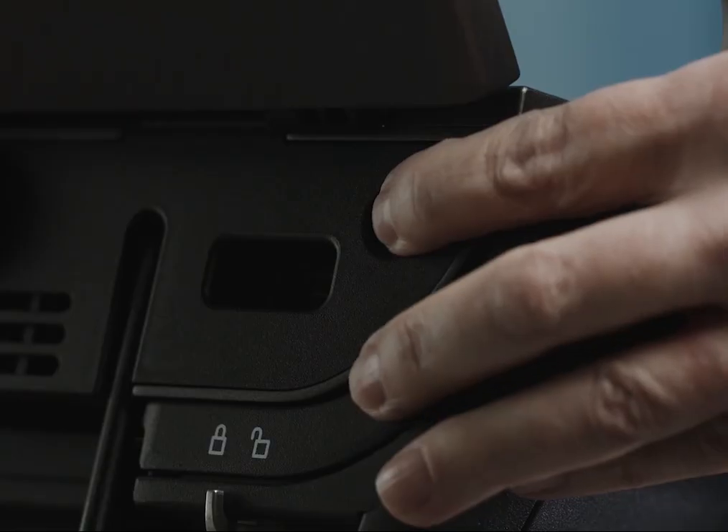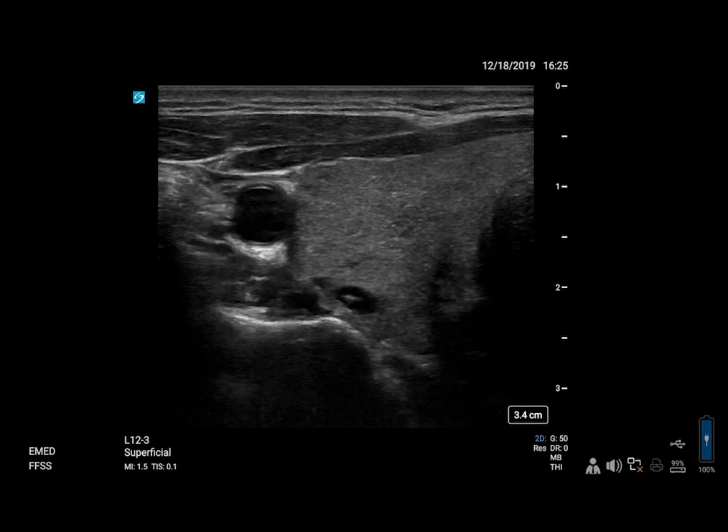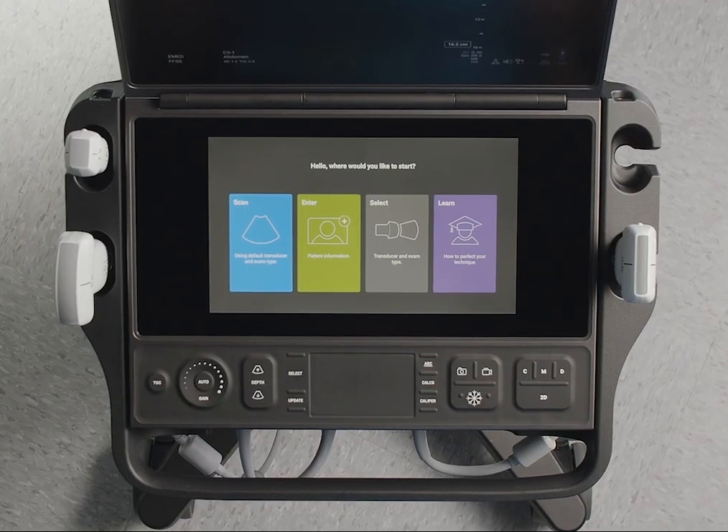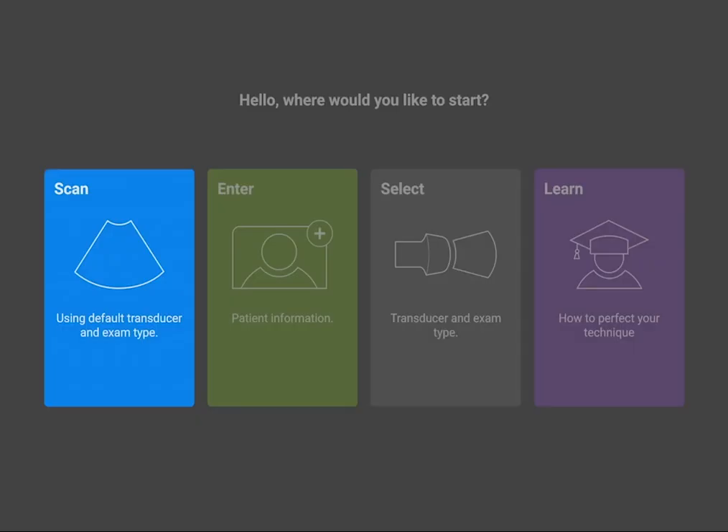When you turn on the system, you can start scanning in the default 2D mode. The Sonocyte PX has several available modules to accommodate your workflow. You can start scanning, directly enter patient information, begin with an exam type, or if you want to learn a procedure, access ScanAlong Educational Tutorials.